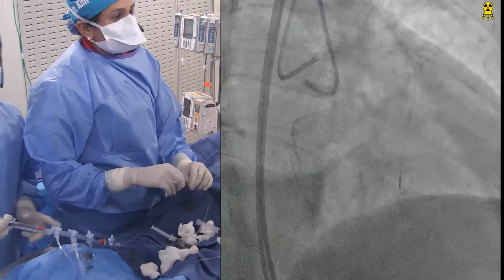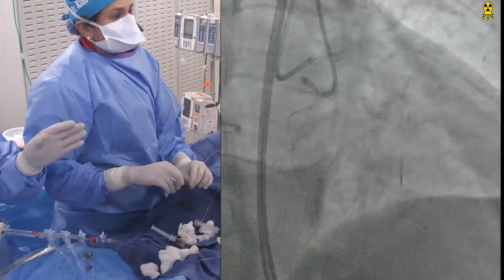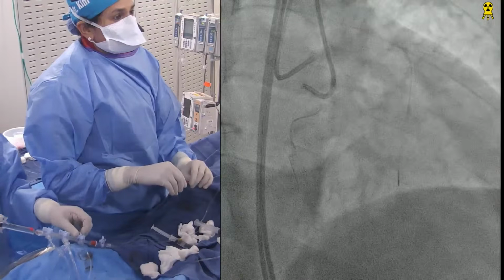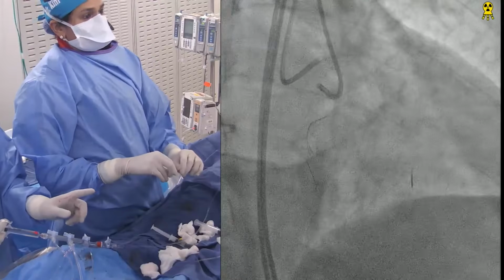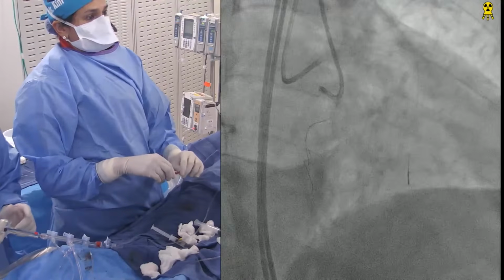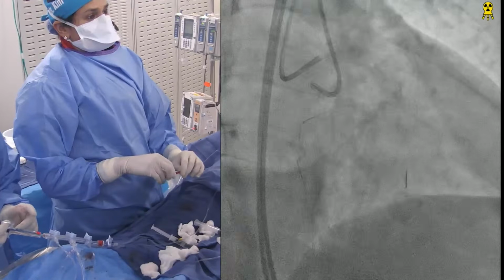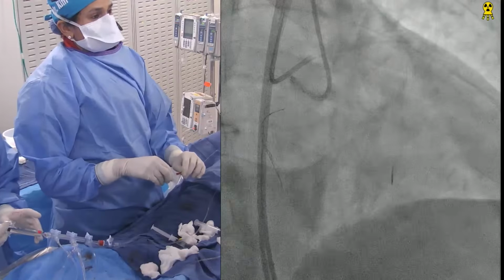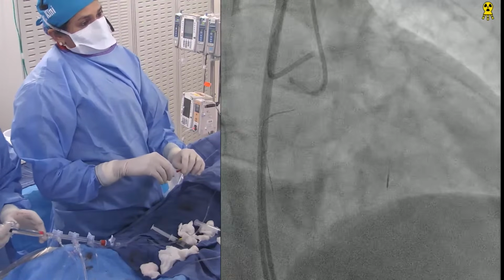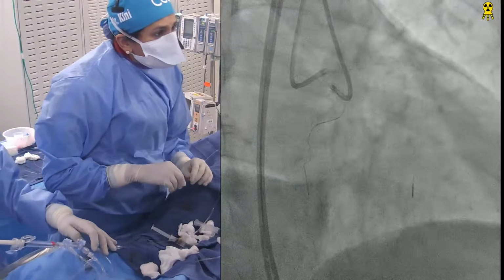So just to say, when they say reverse CART, you need a little balloon support to go to reverse here, or the wire is stuck right there. We are subintimal at that level. Have you taken a cine picture or no? We have. Do I go with the floppy, or is this all subintimal, you see that? And we tried that before. It's exactly how we started the case.